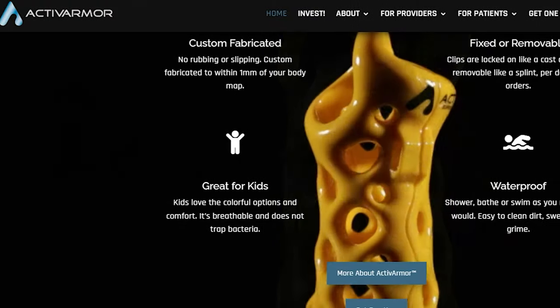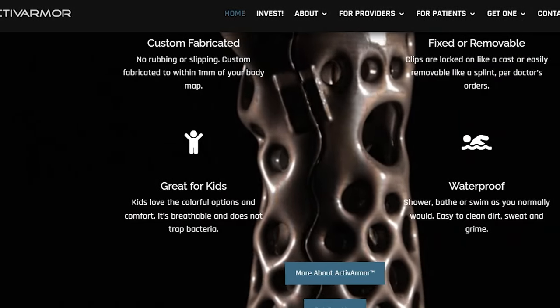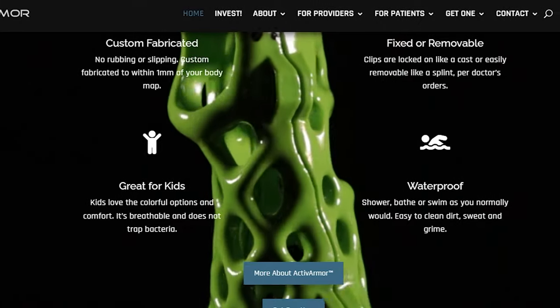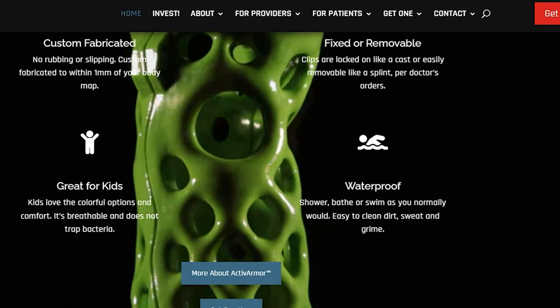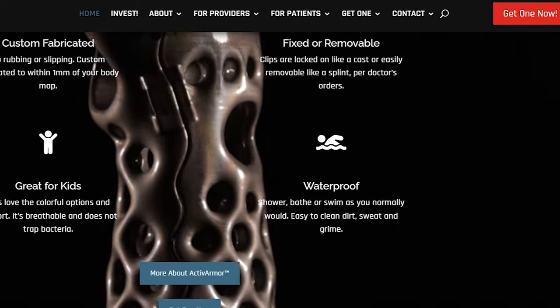3D printed orthopedic casts for broken bones are currently available worldwide in the commercial healthcare market. However, patients receiving free public healthcare are unlikely to have heard about them. This is primarily due to the same lack of the necessary research that clearly confirms the effectiveness and safety of the technology. Still, players in the 3D printing sector hope that research will be compiled soon and the technology will be available to everyone.